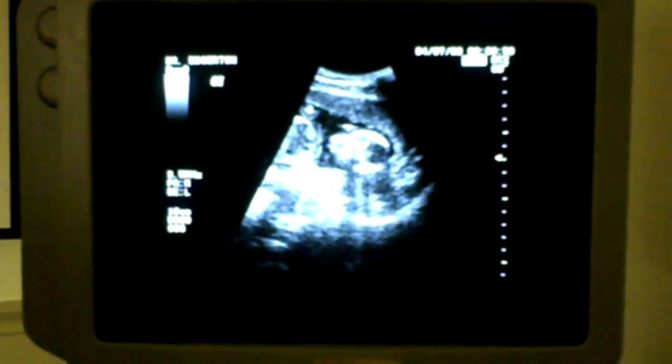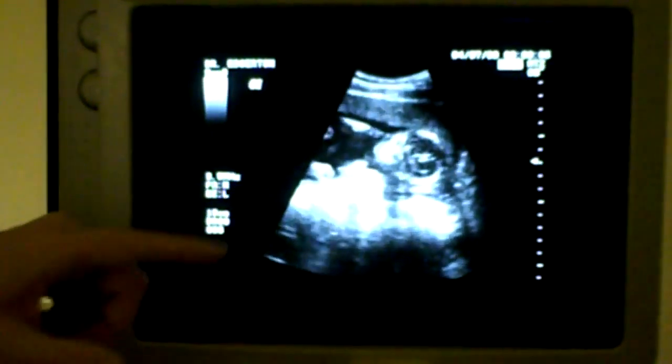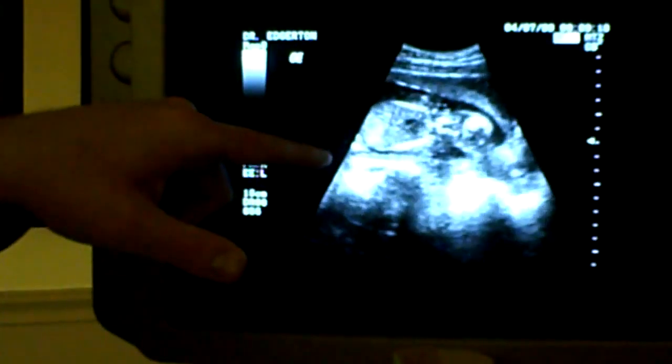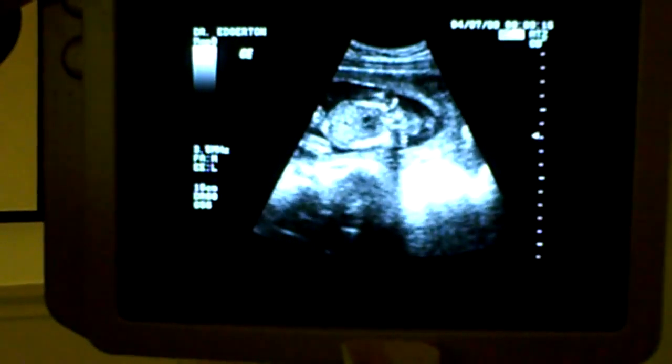You can see the heart — it looks great. The heart is right there, and I can just tell you from experience that that's a good heart rate without even measuring it. Boom, boom, boom — baby's kicking around.